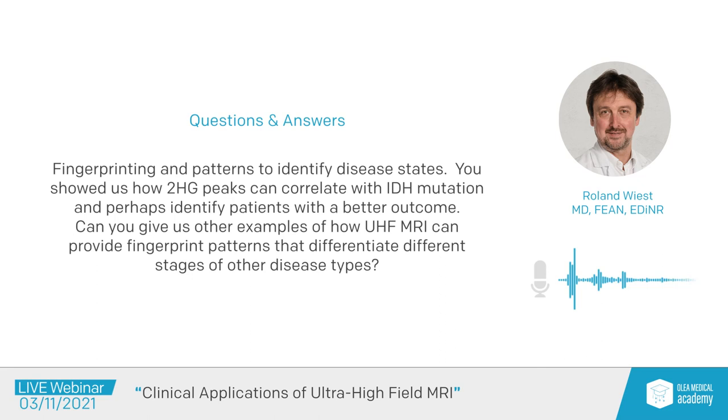So we did not go stronger into the details. One thing I mentioned, of course, is CEST imaging, looking at the concentrations of the different expressions over there. But we have not systematically studied that. One of the options is really to look, for example, at structural omic profiles in epilepsy. So there's also the possibility to use, for example, the segmentation as a readout for further investigations.